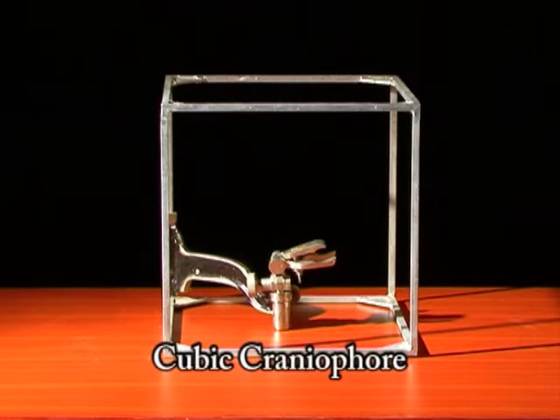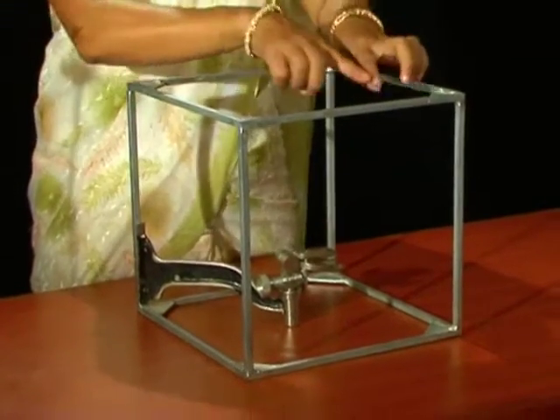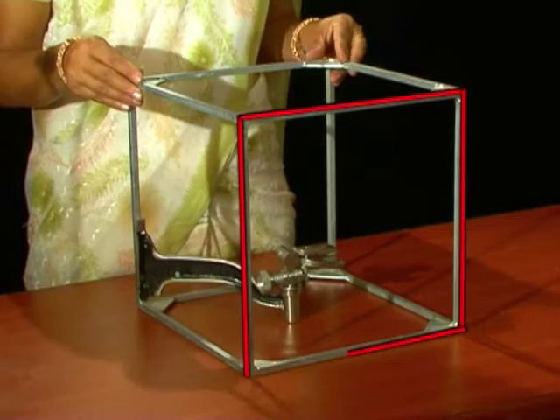Cubic craniophore. As the name implies, the instrument is cubical in shape. It consists of a metallic skeletal cube formed by 12 metal bars with side length of 30 cm approximately.